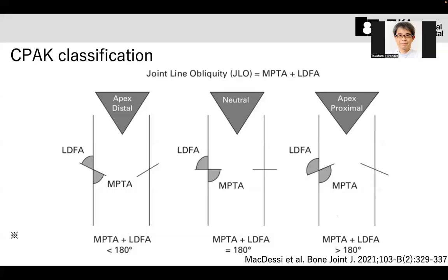As a result, the postoperative joint line orientation comes out laterally inclined. But after kinematic alignment, the joint line comes almost parallel to the floor. But this JLO is a little different measurement from JLOA.